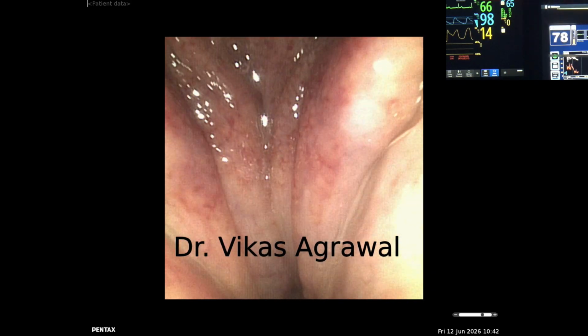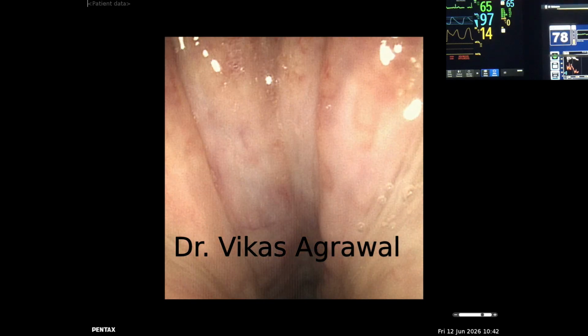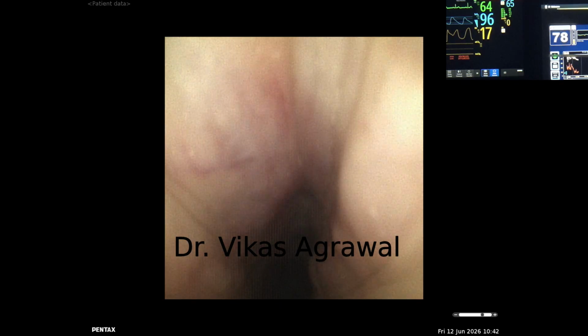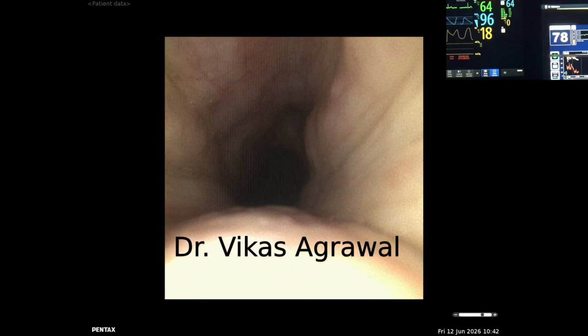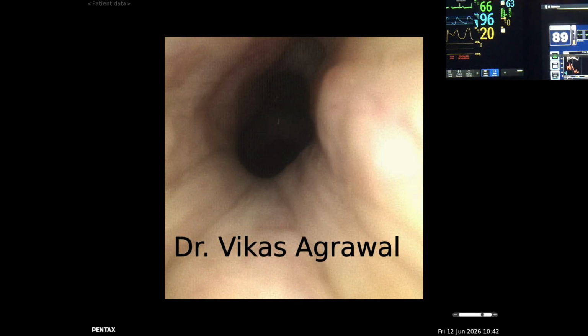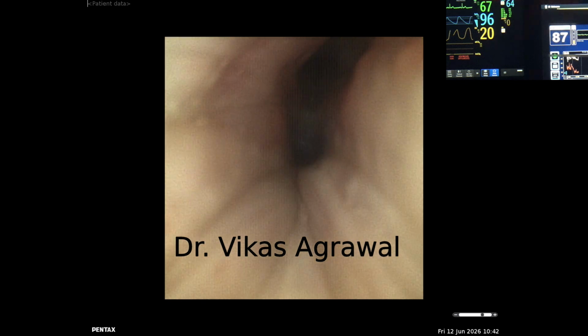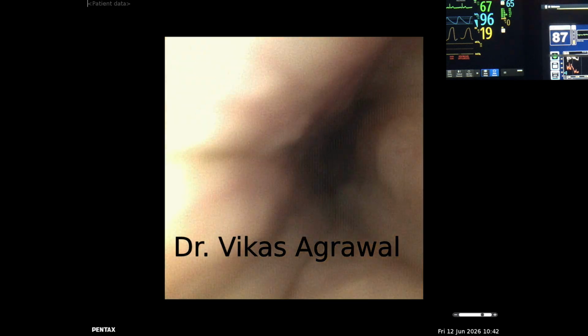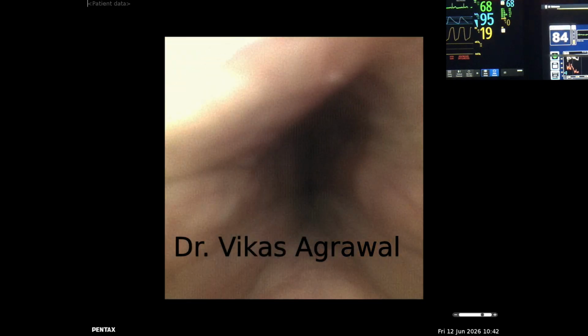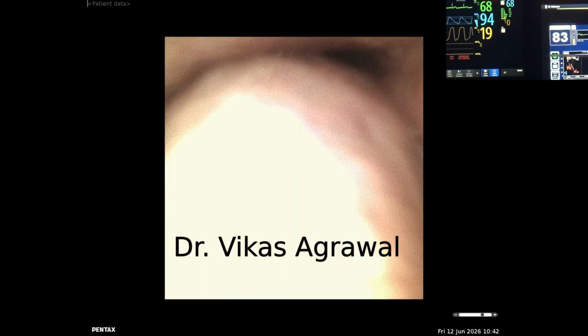There are no adenoids. The salpingopharyngeal folds are also grade 0 by Agrawal's classification. I will not put them a lot of marks. What I see here in the lower part, the collapse is more lateral in the lower part. You can see it's a funnel shaped collapse. The upper part is not collapsing. Lower part is collapsing and it's more lateral.